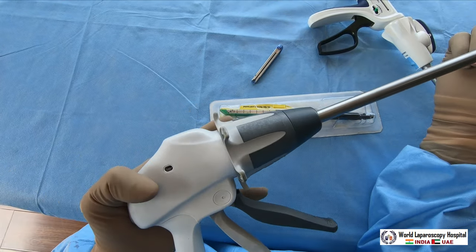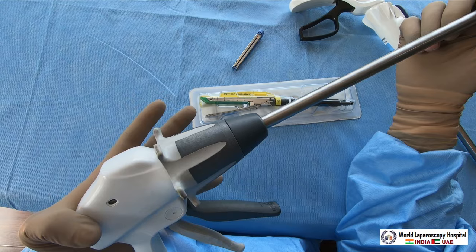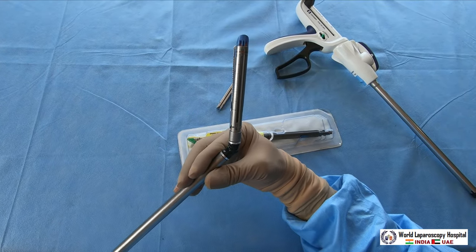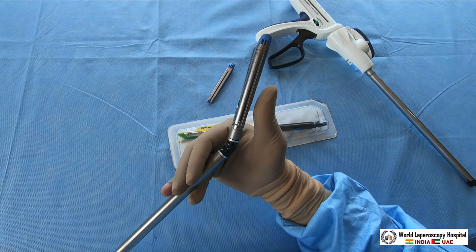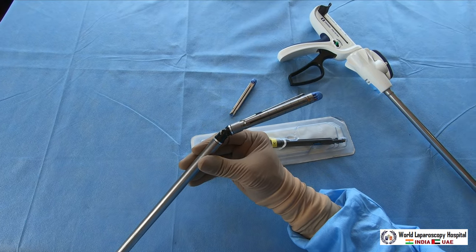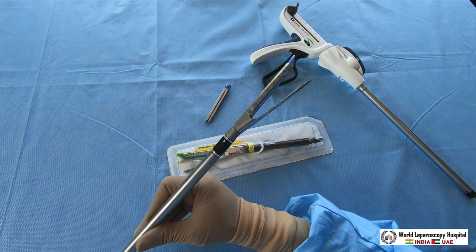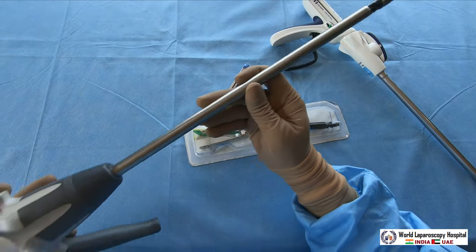To straighten, pull this knob in the direction - once you pull it, it becomes straight. When you press it against a surface it will bend. The tip can articulate in the right direction, left direction, and can be straightened. It can also be rotated. That is why it is sometimes called a roticulator - it can rotate as well as articulate.